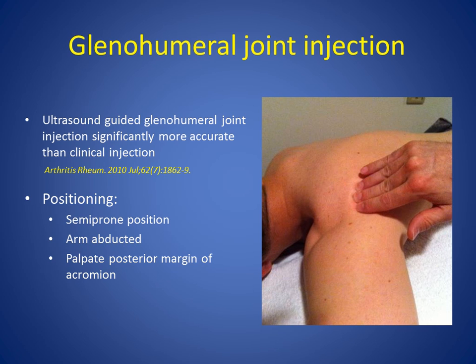In our local experience, the clinical accuracy of this technique in the literature is not published. In our unpublished data of about 35 cases, we've had successful joint access 34 out of 35 times, as proven by intra-articular gadolinium contrast on MRI. So we have about a 97% success rate thus far using this technique at this institution.